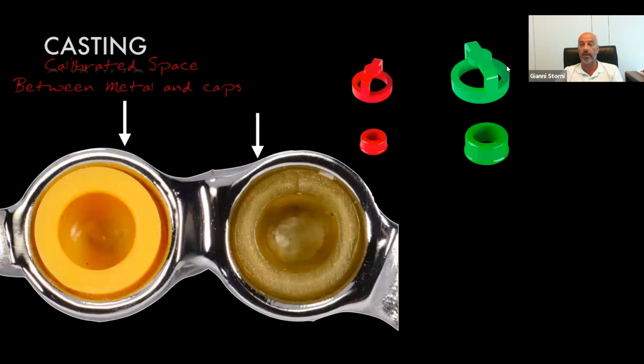because using this prefabricated component is very important, as they are already calibrated by us to leave a little gap for the cap to have elasticity. So it means nice functionality, no squeezing of the plastic. So that helps you to have a very nice functionality of the frame.